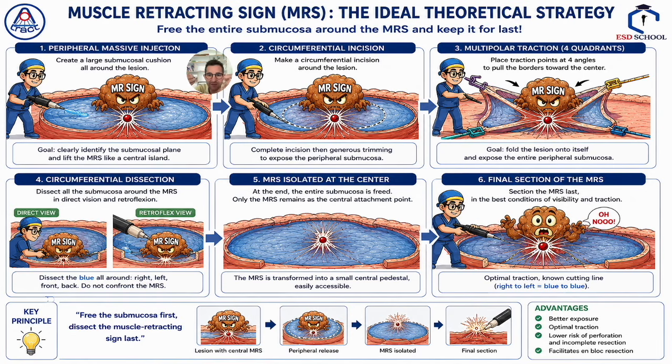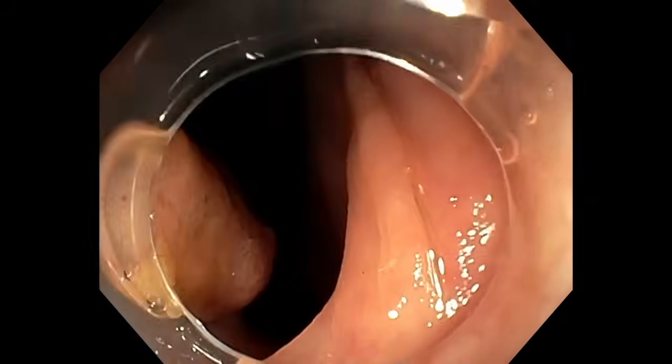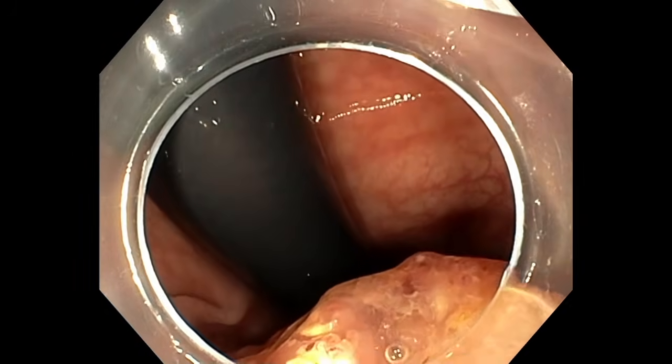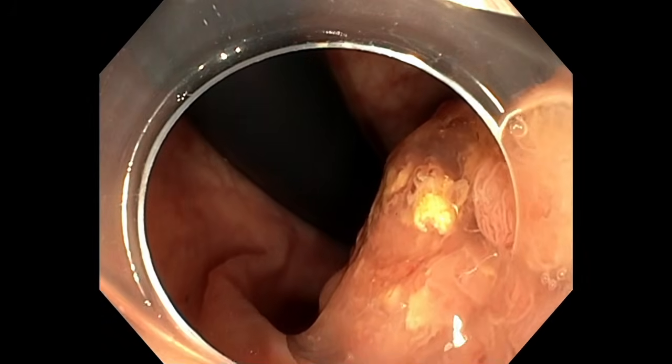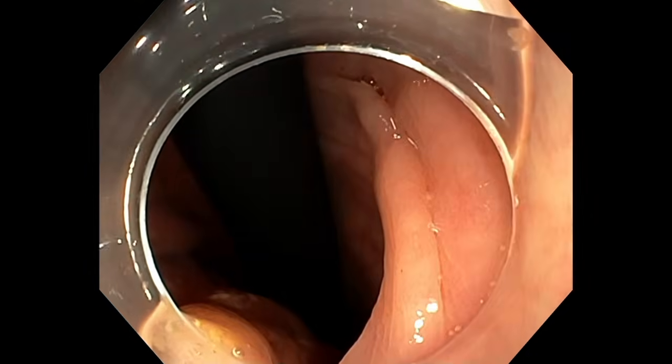So you will not have this difficult situation of perforation within a tunnel where the clip you have to put is difficult to put, and also it can prevent the end of the procedure later. So yeah, once again, for me it's more logical to do like this. Nevertheless, I use the underwater strategy a lot during my progression, during my try to go to the center of the lesion.